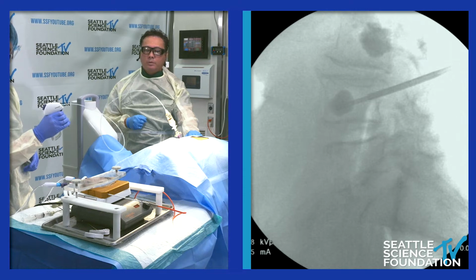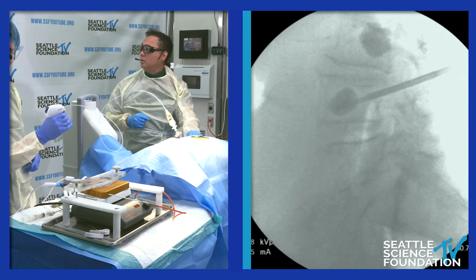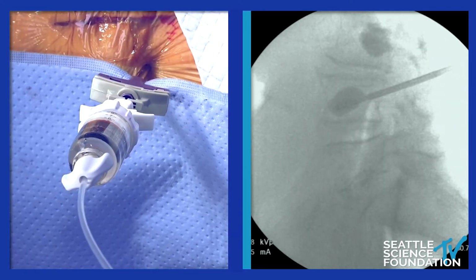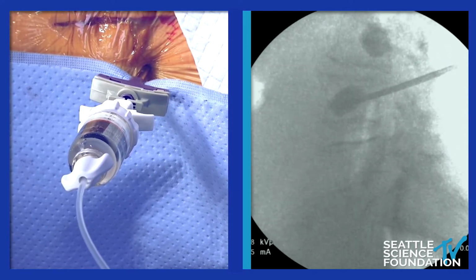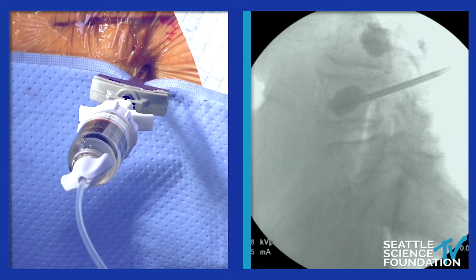And this canister will hold 8 cc's of cement, the X-Speed. Their older cement was more of a low viscosity cement, but if you want to bring up that slide for the different cements, we will shortly. Probably pretty good there, a little bit more. Add a little bit more. Keep going.